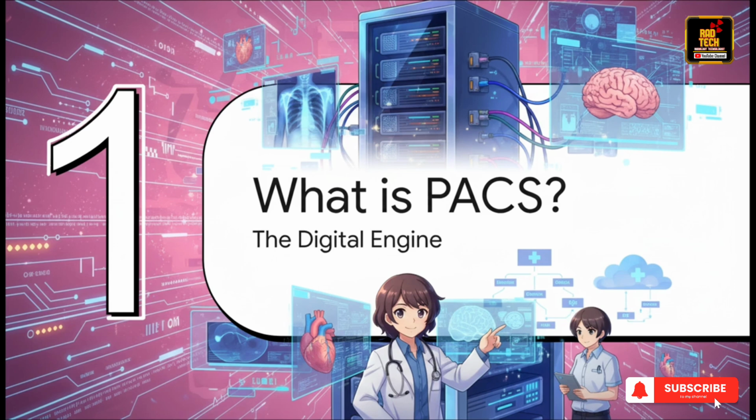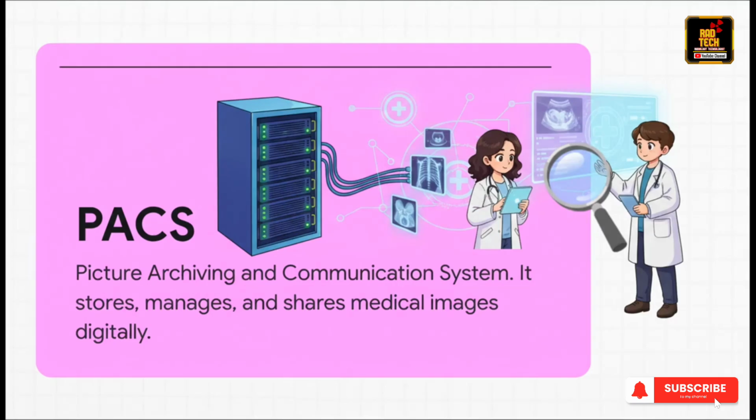I mean, it's completely taken the place of all that old school film you used to see in hospitals. Okay, so PACS stands for Picture Archiving and Communication System. And honestly, the name tells you pretty much everything you need to know. It's the tech that archives or stores all of those medical images, and then it communicates them to the doctors who need to see them instantly.